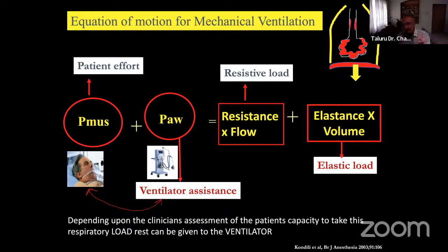After 10 to 15 days, an OP poisoning patient is being weaned, and the lung is better now. The lung after aspiration, or in a pneumonia patient or a COVID patient, after 10 days has recovered well. So then there is no question of safety. We only consider comfort and weaning. So the modes change. That is what you have to understand. This is what we don't have in an anesthesia setting.